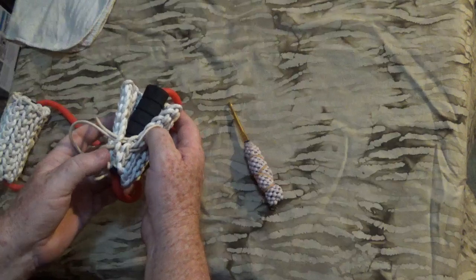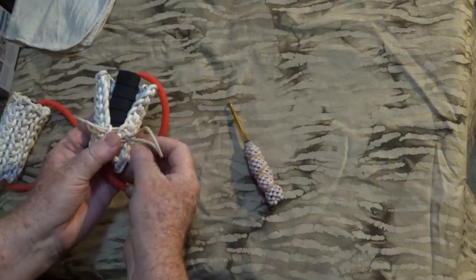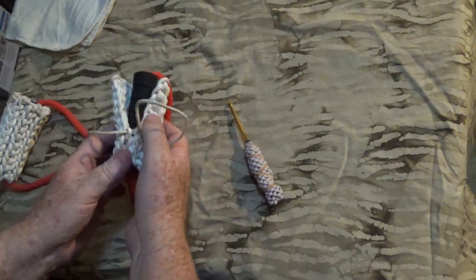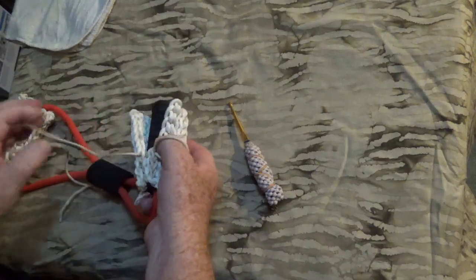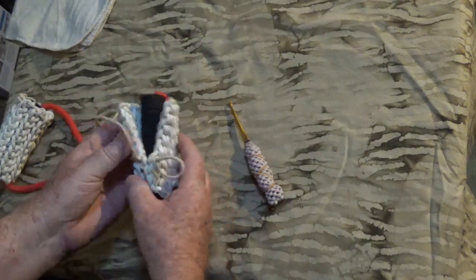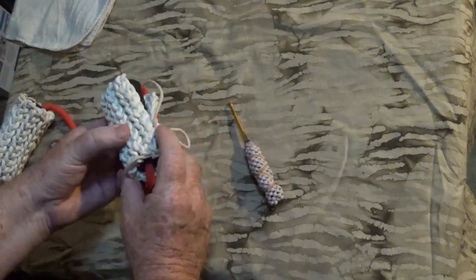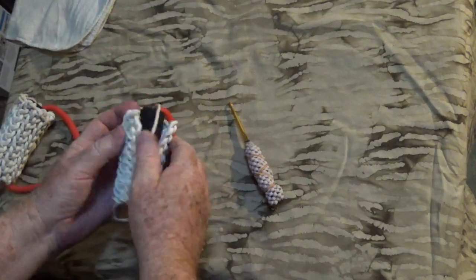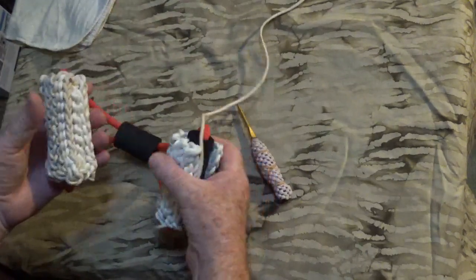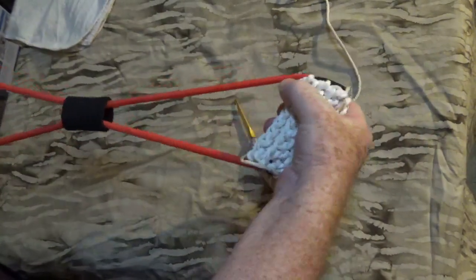That's tightened now. And we're going to pull the bottom of the new loop to close that old one off. Then I just put your thumb there, bring it down to a comfortable size, and continue working your way up, and you just bury your ends in the crocheted loops, and you end up with a nice round handle to where now it no longer grips around my hand. I have handles.